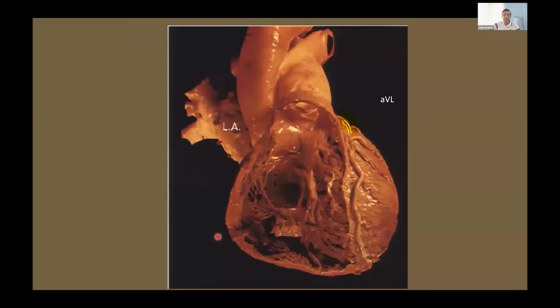So going back to basic electrophysiology principles, here you have the right ventricle where the right ventricular free wall has been removed, showing you the cavity of the right ventricle, and this is your left ventricle over here. I've just schematically drawn a left-sided pathway. When you have a left-sided pathway bringing the impulse down, you would expect this part of the ventricle to get activated first, and the impulse from there to travel on towards the rest of the myocardium. So the vast majority of electrical activation is going to be traveling away from lead aVL or lead 1 or any of the left-sided leads.